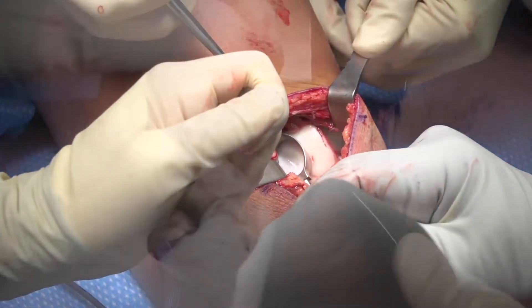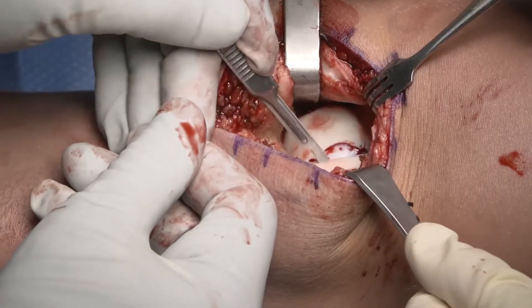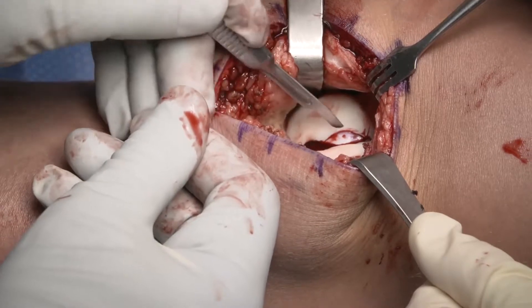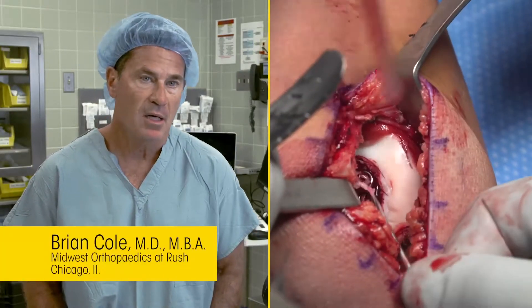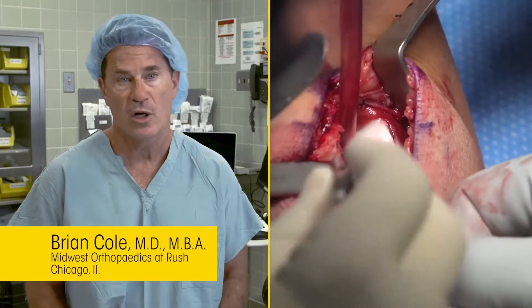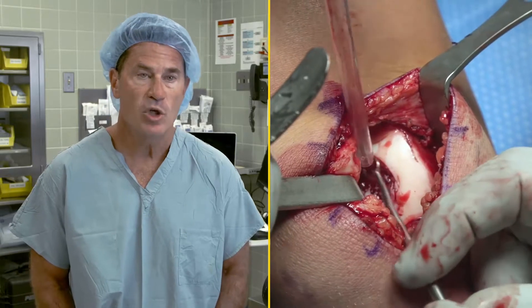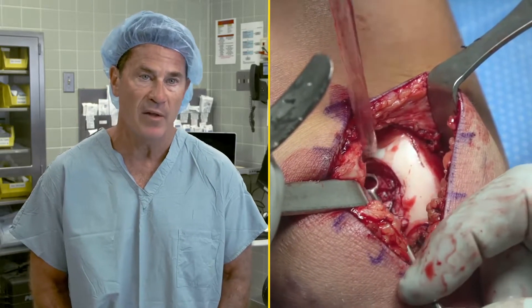Once we scored with the custom cutting guide, we use a 15 blade to start to debride the fibrocartilage and surrounding damaged cartilage up to the adjacent normal margin. We'll use a ring curette to maintain the vertical walls that the custom cutting guide established and go down to the calcified layer. We do our best not to violate that area in any significant way to minimize the amount of bleeding that can occur.